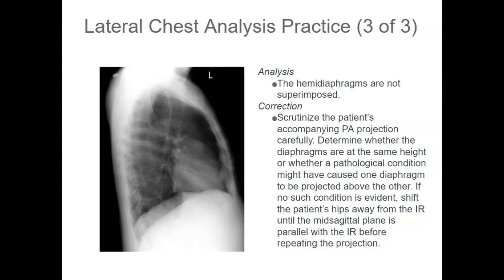Also, maybe the patient might have some shift in their hips. So make sure that you take a look at the patient as a whole and review imaging prior to taking a repeat image.